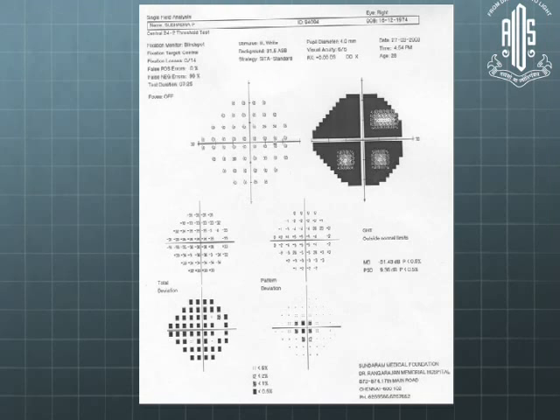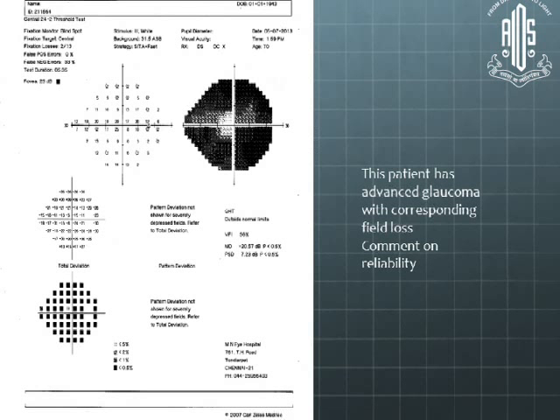This is a patient who sat through the entire test. When the patient was told to sit in the machine and look for the stimuli coming on, the patient did just that without pressing the button. You will find that the result was 99% false negatives. The patient was not told to press the button.